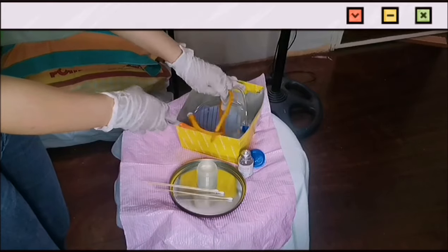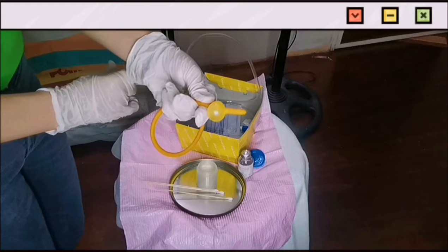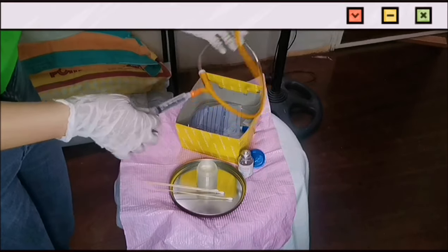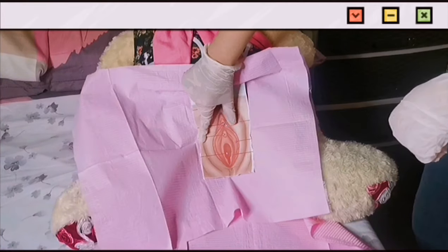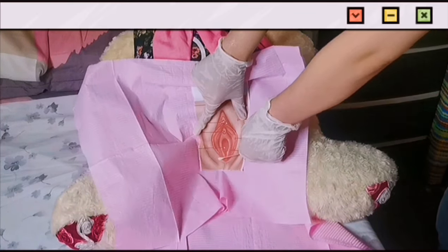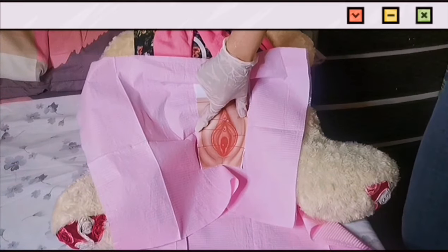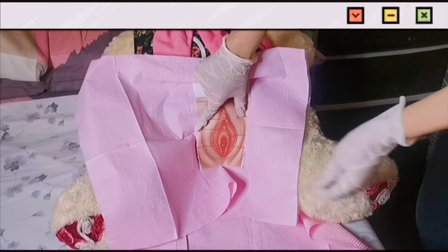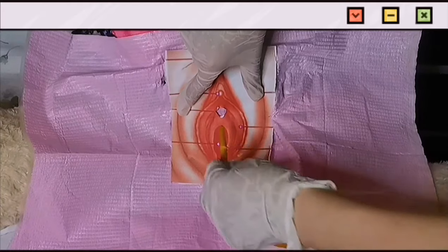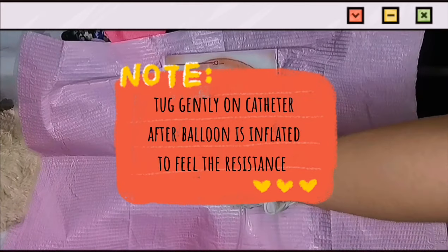First, we will test if the balloon will inflate. Yes, it's good — we will deflate it now. With your non-dominant hand, use your thumb and fingers to spread the labia. Then with your dominant hand, swab — first away from you, get rid of it. Another swab stick is towards you, get rid of it. The last swab stick is in the middle, get rid of it. So Ma'am, please take a deep breath. First inflate the balloon, then give it a tug — it is secured.